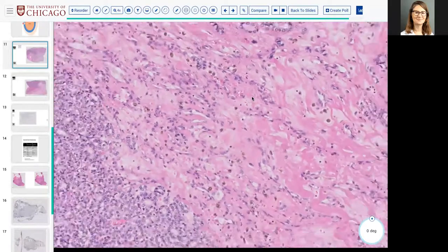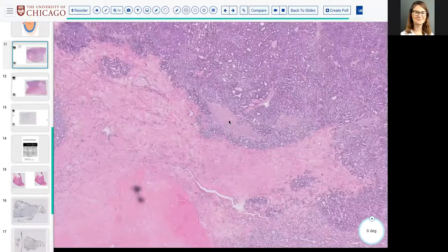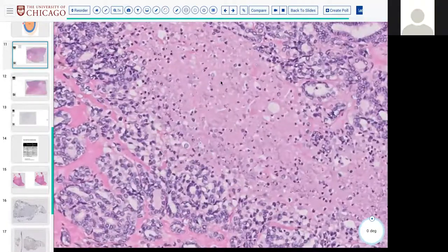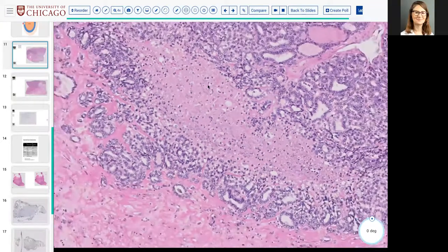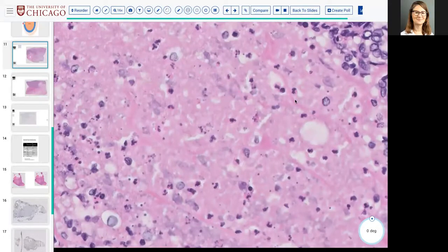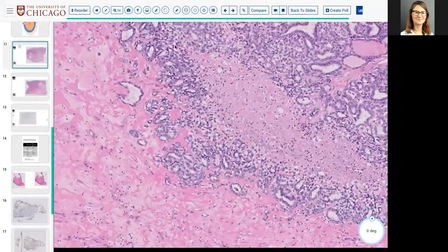There's fibrosis and hemosiderin, which could be FNA, but when you start to see necrosis, I agree with you. When you start to see this punctate tumor necrosis, where you have ghosts of cells with karyorectic and neutrophilic debris that is surrounded on all sides by viable tumor, this is not FNA, all right?